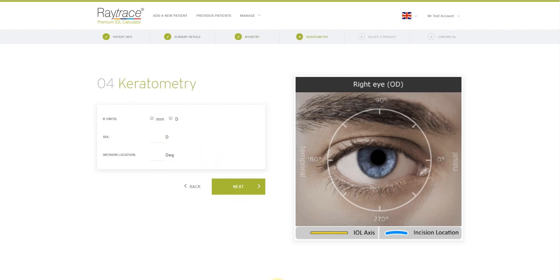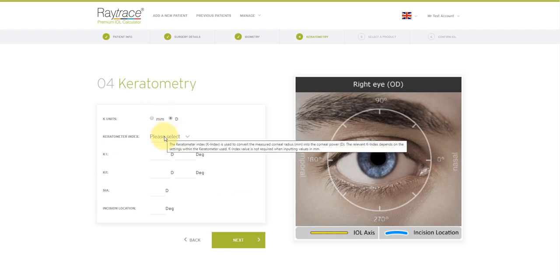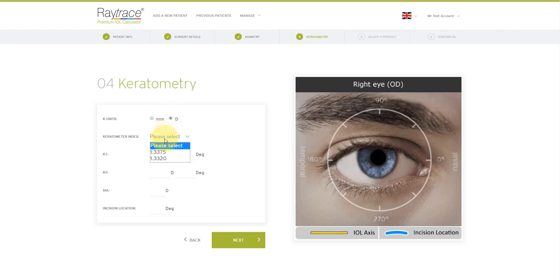Now you need to add your values for your keratometry. You can do this in millimeters or in diopters. For diopters, you will be asked to choose the index used by a keratometer. Now you need to enter some K readings.